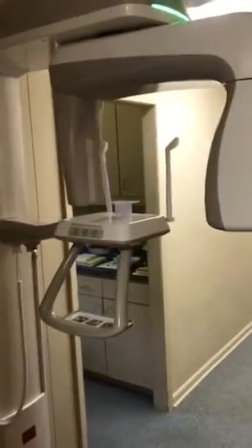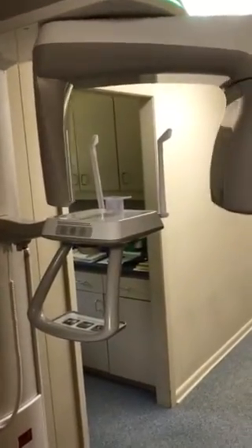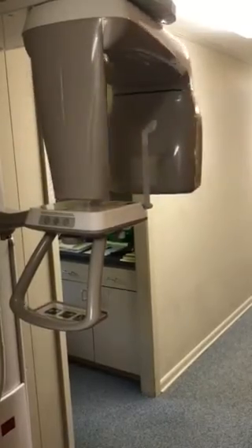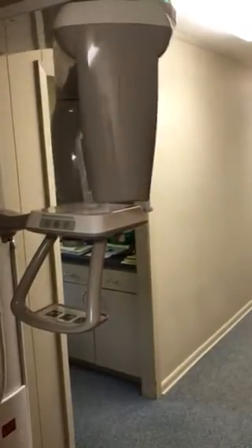Patient needs to stay in there until this rotates back around, and then they can come out of the machine, but they need to stay in there until it returns. Of course, hang the exposure button back on the wall.